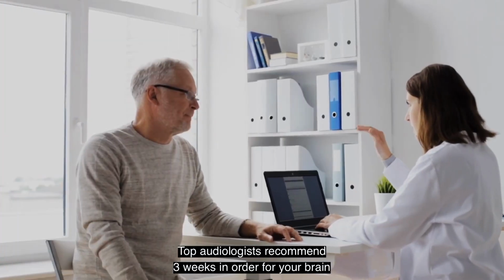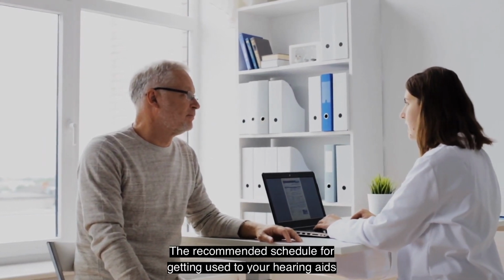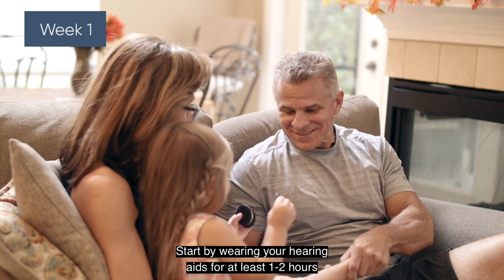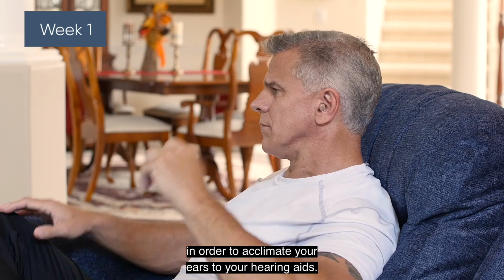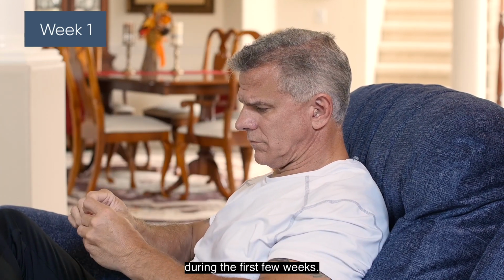Adapting to your hearing aids will take some time. Top audiologists recommend 3 weeks in order for your brain to adapt to wearing hearing aids. The recommended schedule for getting used to your hearing aids is as follows. Start by wearing your hearing aids for at least 1 to 2 hours per day while living your normal routine around the house in order to acclimate your ears to your hearing aids. It's normal to get irritated by the fit of your hearing aids during the first few weeks.